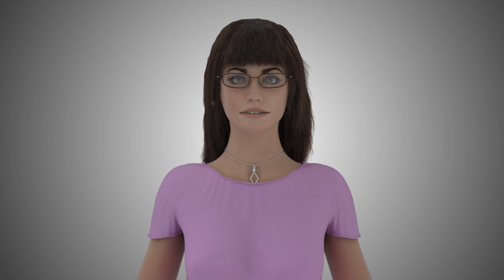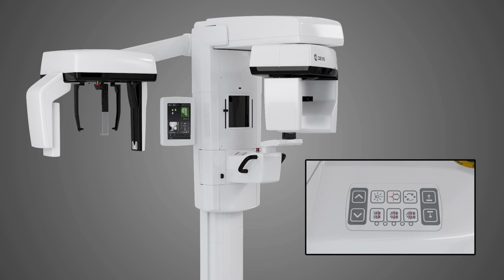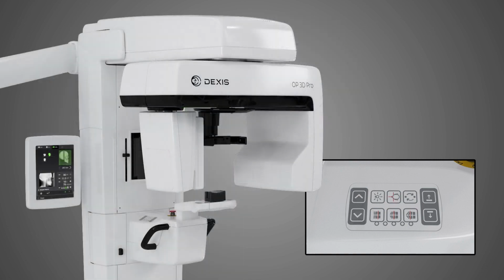Prepare the patient for the procedure by asking the patient to remove any metal artifacts, including earrings, necklaces, hairpins, or removable appliances from the shoulders and above. Properly place a protective lead apron over the patient in accordance with your local regulations. Press the Patient In button from the positioning panel on the unit. The unit will rotate into Patient In position.